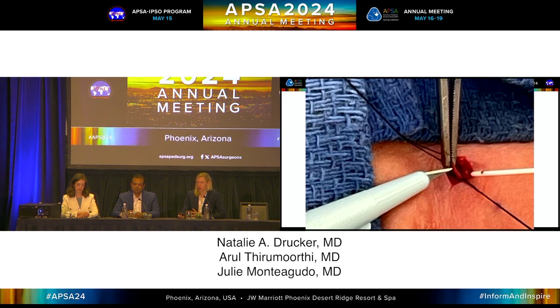When you pass it in, it should pass freely. It should go all the way in. It's going to go into the IVC. If it doesn't, or it stops somewhere, it's probably in a lumbar. You should pull back pretty much all the way to the venotomy and try again, kind of twist it in a different angle. And those are just tips and tricks to get it in there.